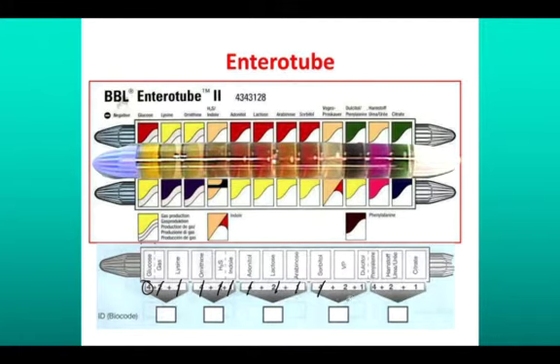And we don't run the VP at first. We're not adding any reagent. Here, it did not turn yellow, but it's not green anymore. We take a look here. It's this kind of darkish brown. So this test, although negative for dulcitol, is positive for phenylalanine. You can see the urea test turned a nice bright pink. So that is also positive. But the citrate test this time did not, and that is negative.